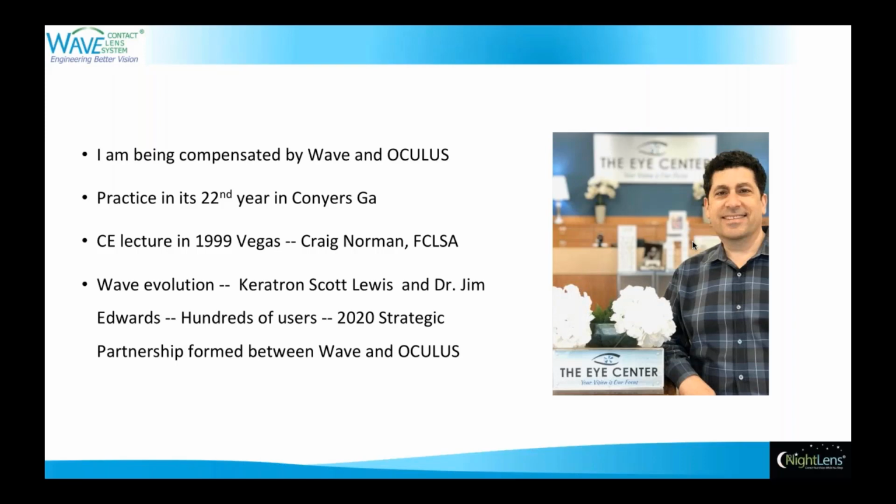And so they were talking because their booths were right across from one another. And by Sunday, Jim Edwards purchased the topographer, and basically that's where the relationship started. They hatched up a plan to design contact lens software, importing the topographic data to make a custom design gas permeable contact. And so we're 500 WAVE users later, and it's quite an extraordinary thing.